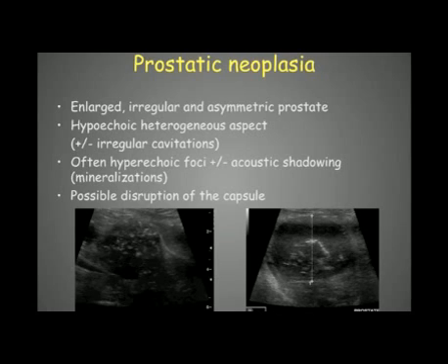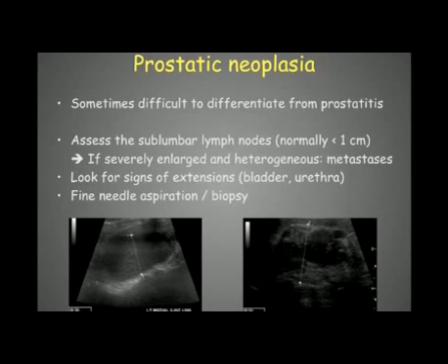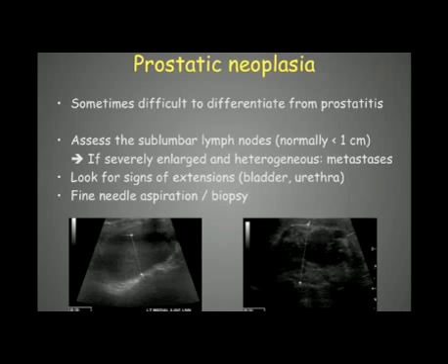There may also be disruption of the prostatic capsule. Prostatic neoplasia can be difficult to differentiate from prostatitis. To help, assess the sublumbar medial iliac lymph nodes — normally less than 1 cm — if they are severely enlarged (here almost 3 cm), hypoechoic, or very heterogeneous, this confirms metastasis and therefore neoplasia. Extension into the bladder or urethra also favors neoplasia. Fine needle aspiration or biopsy under ultrasound guidance can be performed for definitive diagnosis.